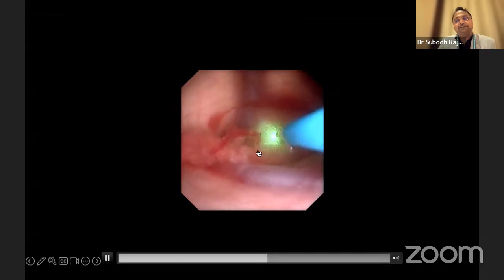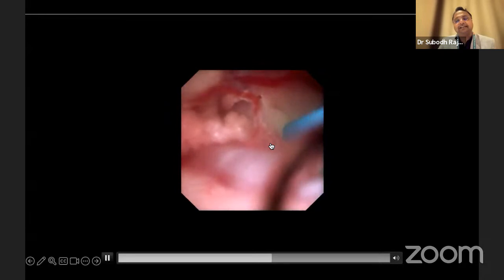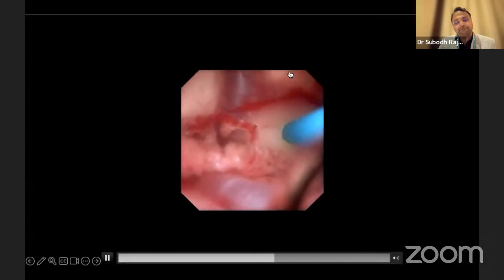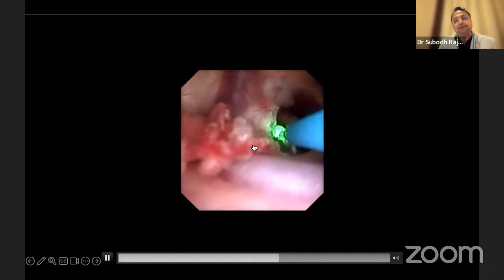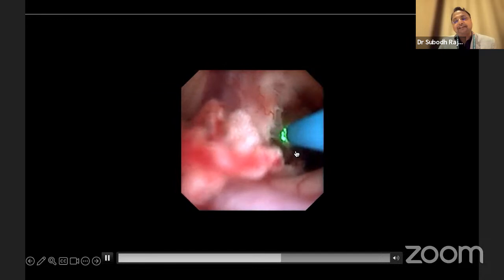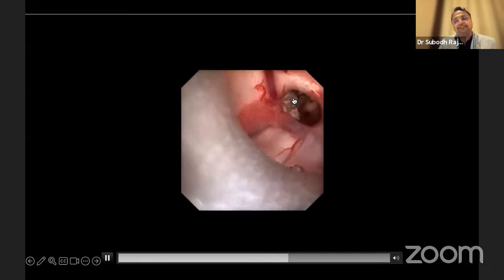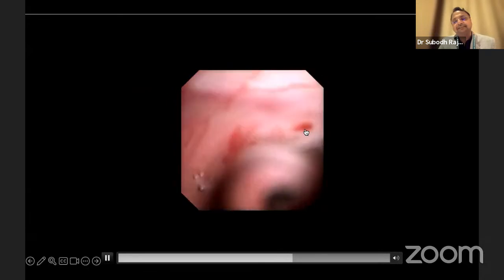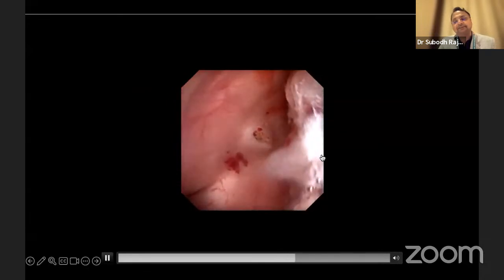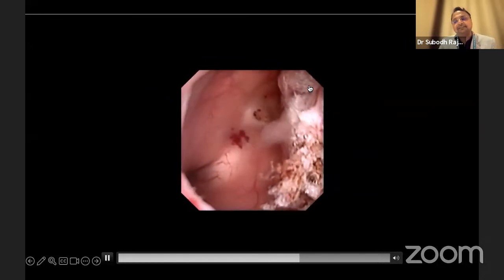So what we did was we again coagulated the choroid plexus here, opened up the cyst here, and evacuated the content completely from the opposite side also. So basically a type of disconnection of the choroid plexus from this side helped us in minimizing the bleeding. This is the main culprit when you put traction on that. And once we did that, we came to the ipsilateral. This is the opposite side. You can see some of these. This is the choroid plexus only.